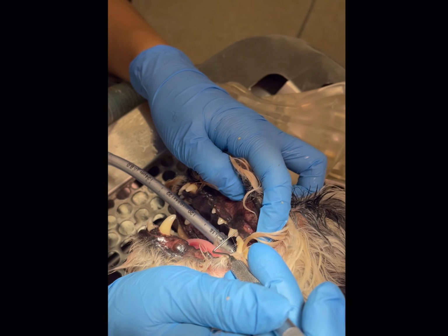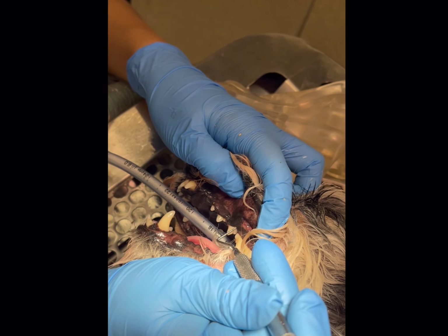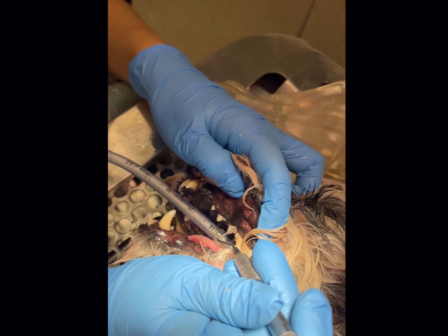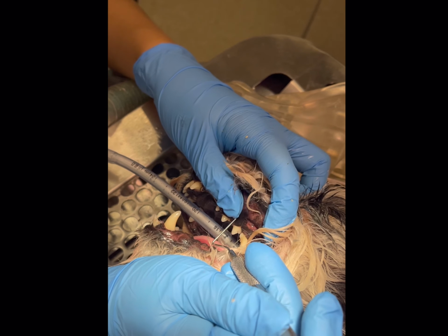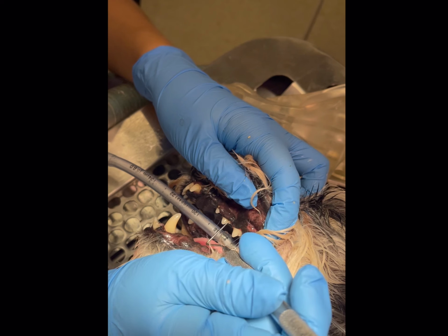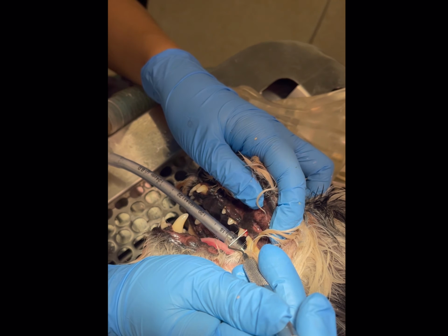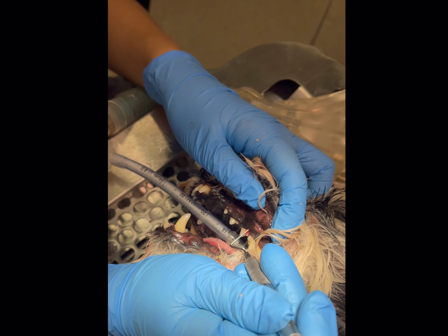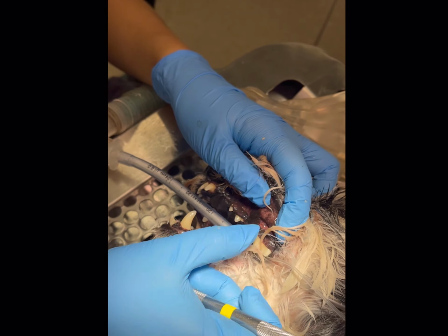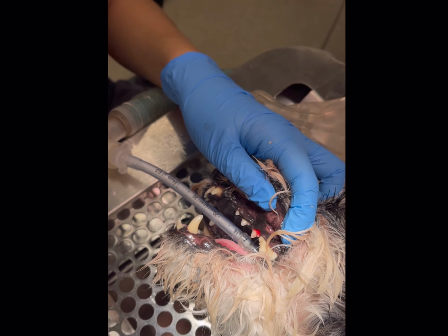But when we go in with our dental probe, you can see that it dips down, way down below the gum line, which is abnormal. It really should only come down to about the 2 mark. So obviously that's abnormal. A tooth like this is normal. So this is the problem that's causing the swelling in his face. And it is infected underneath the gum line, even though it looks relatively normal.